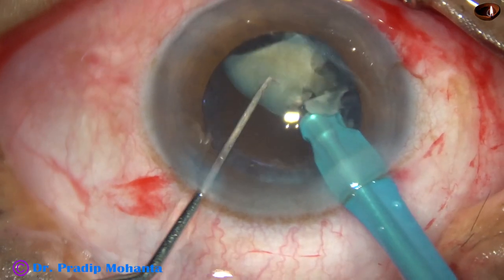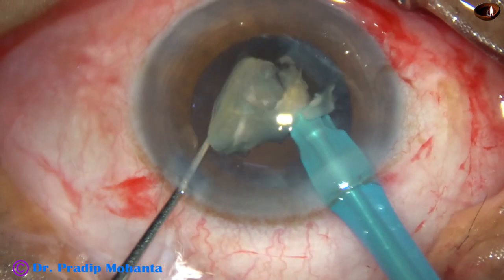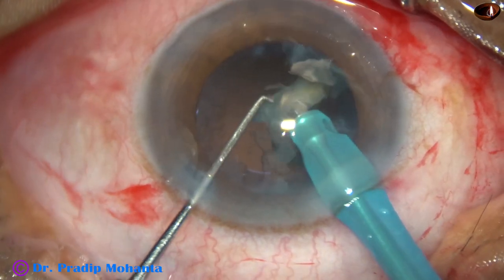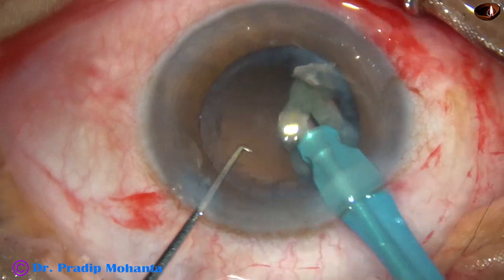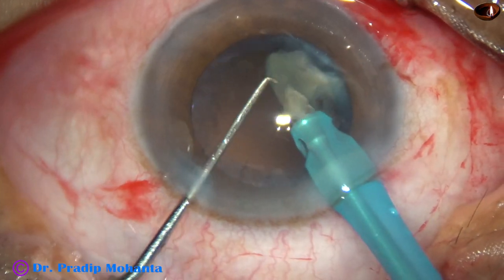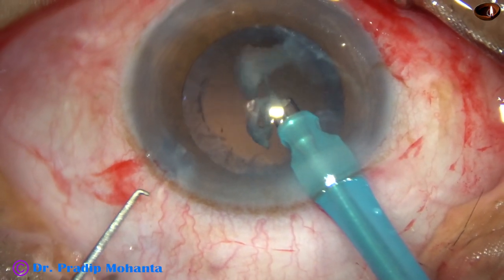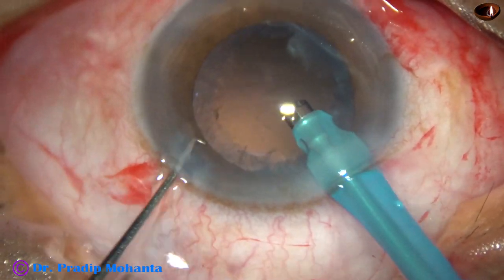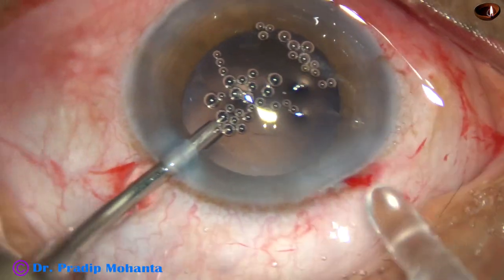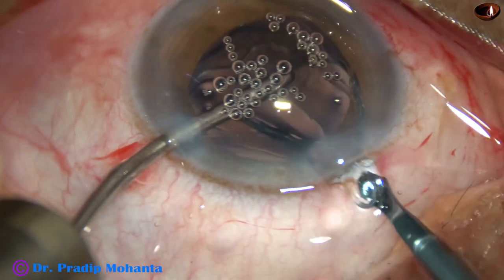This is the last nuclear piece. At this time the vacuum has been reduced to some extent, and very slowly, very cautiously, keeping an eye on the posterior capsule and how it is behaving, the last fragment is emulsified. Sometimes I remove the chopper during emulsification of the last piece so that leakage from the side port stops and the chamber becomes more stable.